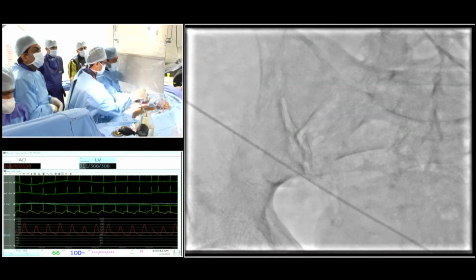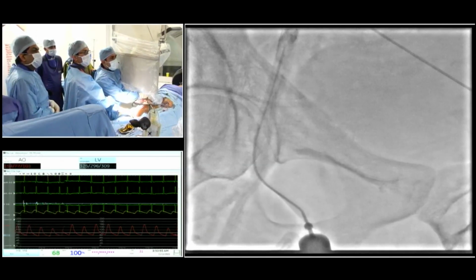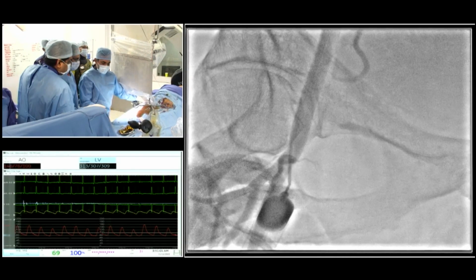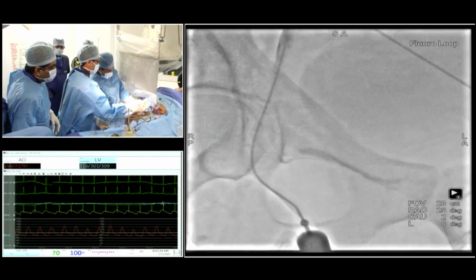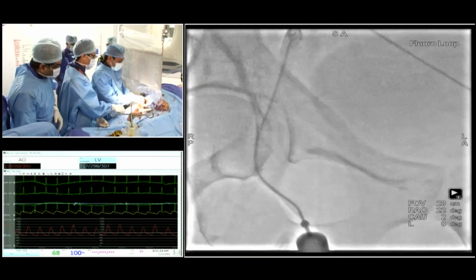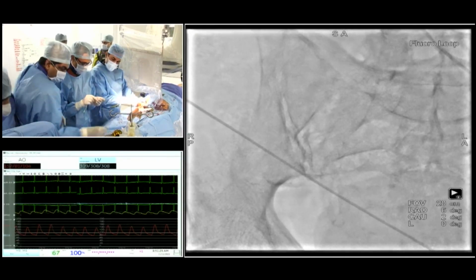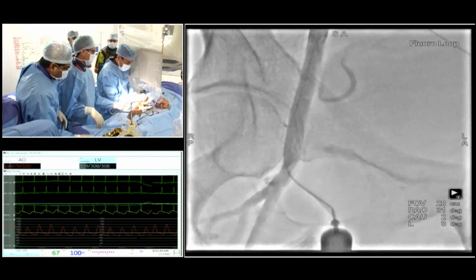So you saw an ultrasound-guided access where we would identify the common femoral artery. Go ahead, show us down, please. Yep, we saw that. And then also confirm on the angiogram. Beautifully demonstrated. So after this, what is the balloon expandable valve you're using? Edwards Sapien 3, 29 millimeter, which is 3% oversize. Super. What would you do in such a case, Dr. Gopalamurugan? Same. Edwards Sapien 3, 29. Exactly, pretty much what you have suggested.